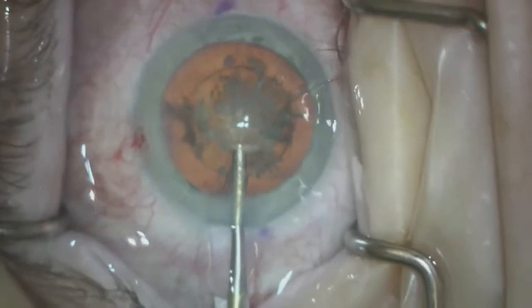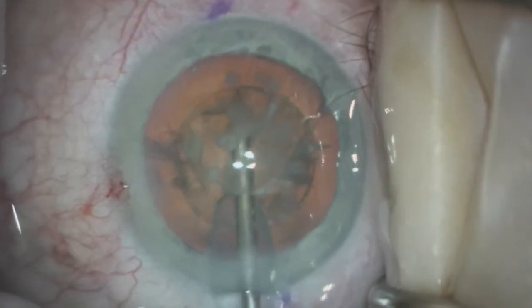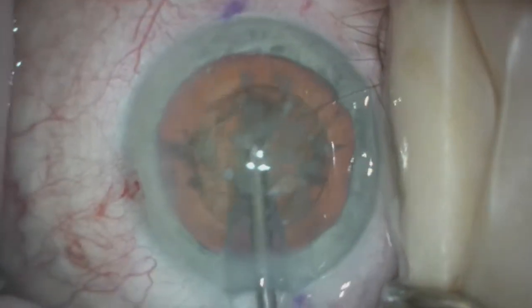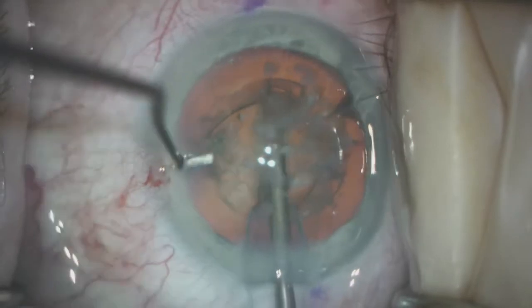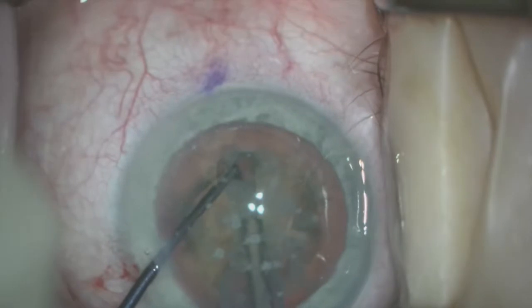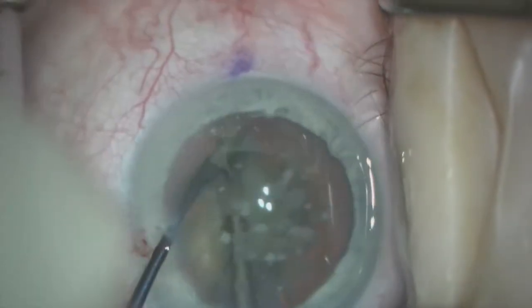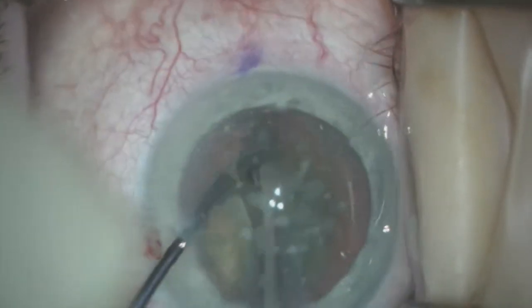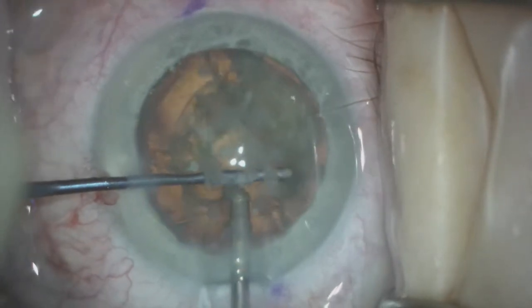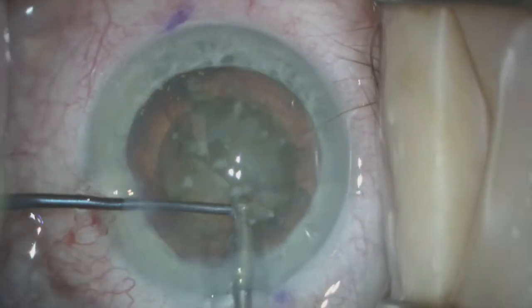We also wanted to discover how the LensX laser performed on patients with this rare corneal condition. Here we're starting our usual phacoemulsification. We used the second instrument, which is an Olsen chopper made by Epsilon Instruments — it helps in so many different ways, from cracking the lens to spinning it to maneuvering the iris in patients who have a miotic iris intraoperatively.